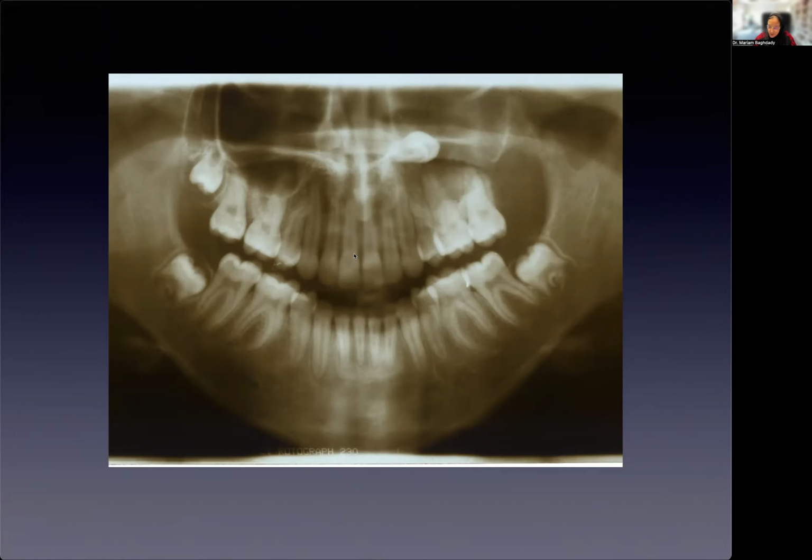So the issue isn't getting in trouble. The issue is about making sure that whenever we're ordering our radiographs, you have to remember that as the referring doctor, as the one reading these images, you are responsible for the entirety of the field of view. And if there's anything wrong, and if it's obstructed with something else, it's still your fault. It is still your issue. Let's not say your fault. It is still your issue. So make sure that you can visualize everything.